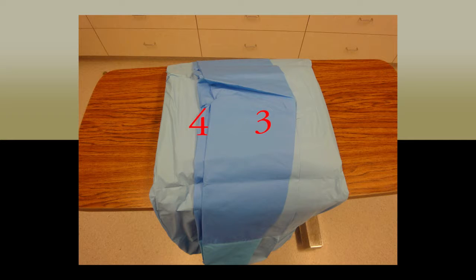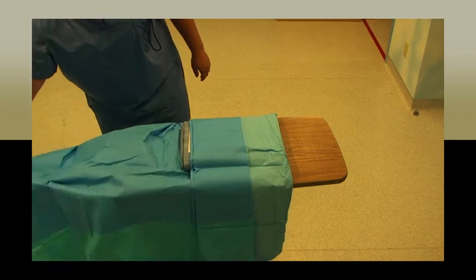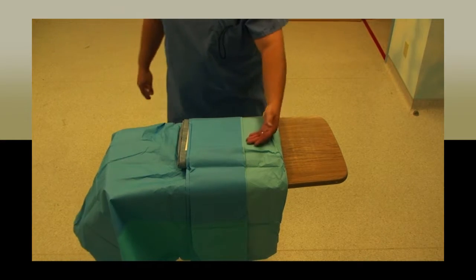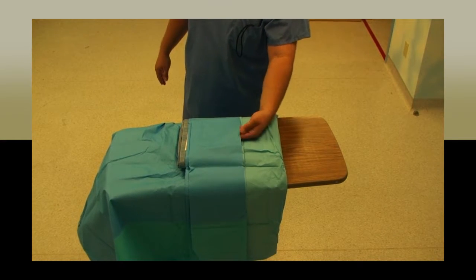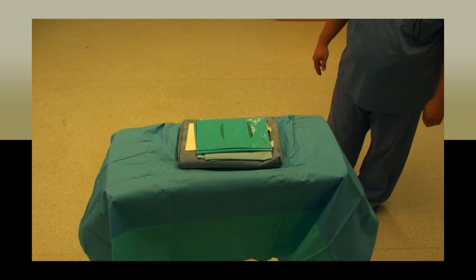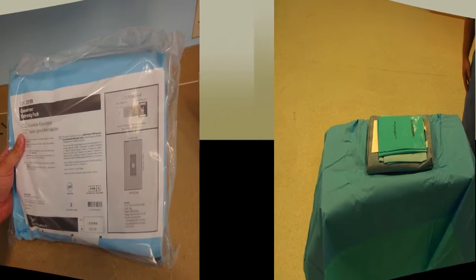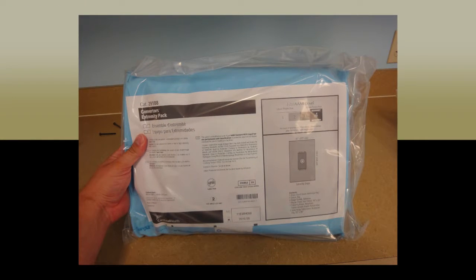Using the same procedure you used for fold 2, you'll grip underneath folds 3 and 4 and pull them to either side, dropping them to the sides of the table. This has now created your back table sterile field. This will form the sterile field in which you will build your instruments and your extremity pack and drape. We use different extremity packs depending on the procedure. For endoscopic plantar fascial releases, we will use the plain small extremity pack.